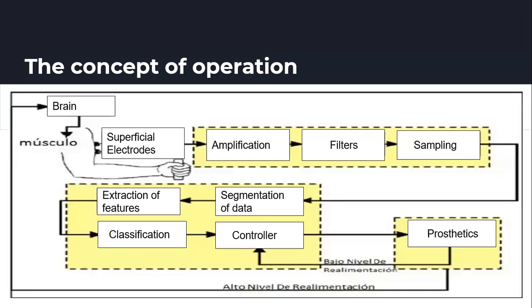In this model, pre-selected characteristics are calculated and presented for a later classification of them. In this way, in the classification stage, there will be an efficient process. The classification in this model recognizes patterns in the signals, which are classified by predefined categories.